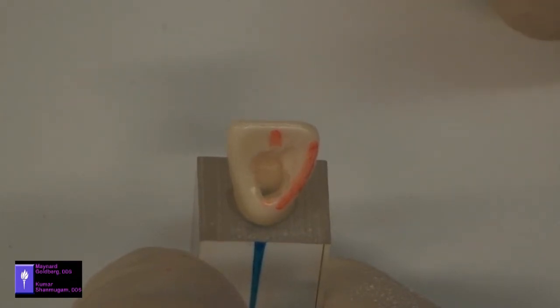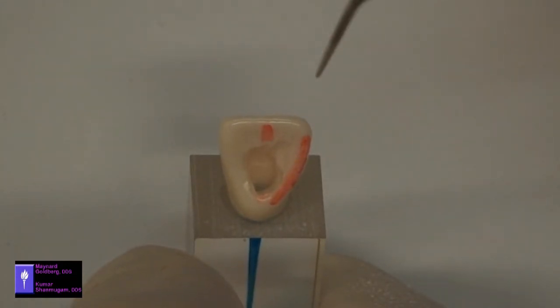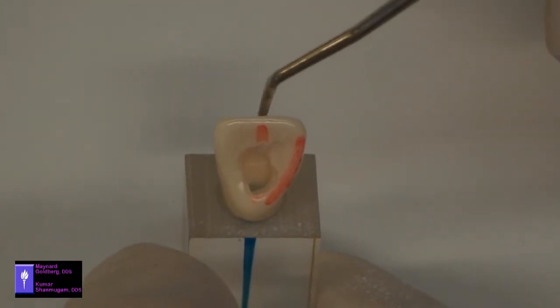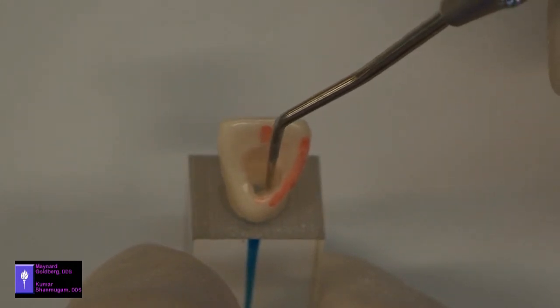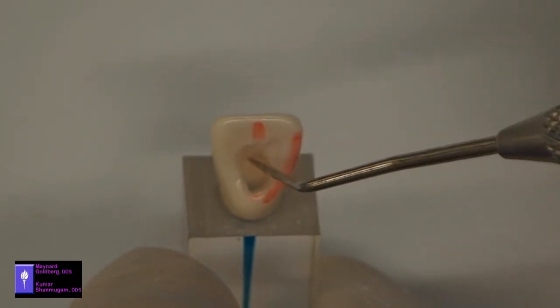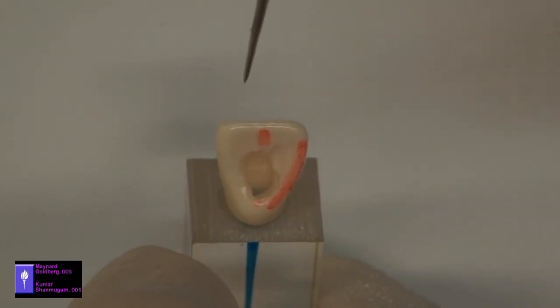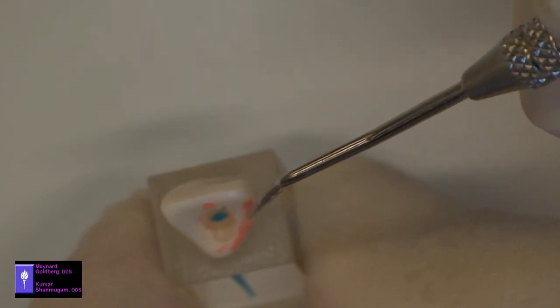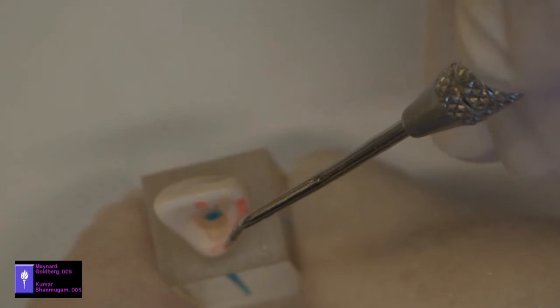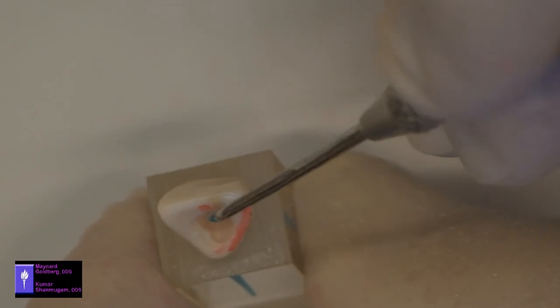This is an access cavity that has multiple errors. From this ledge over here, I could tell that the handpiece was not in the long axis of the tooth, which is parallel to the labial incisal two-thirds, which would have been like this. Instead, it was held like this, and the burr went into the wall. Also, it is up too high on the incisal edge. Because of the poor positioning of the burr on the tooth, it was placed too close to the edge of the cingulum. A ledge was created, and it covers part of the entrance into the canal, the orifice to the canal.